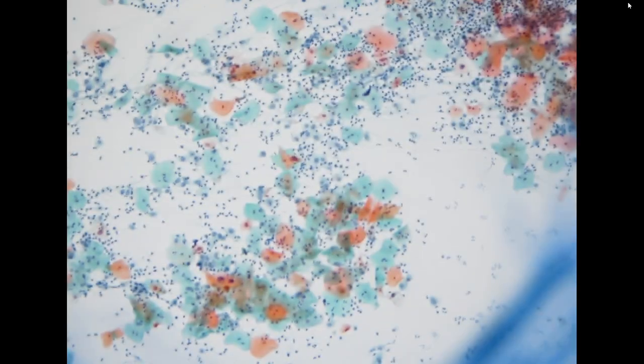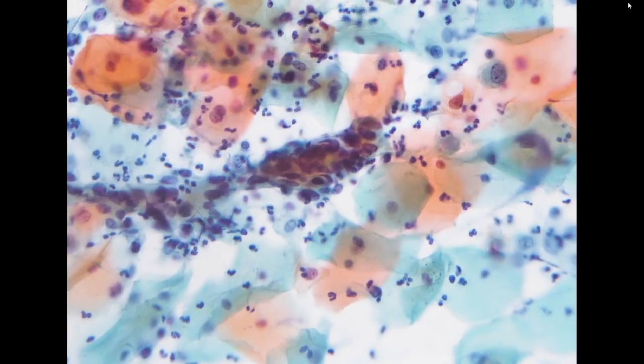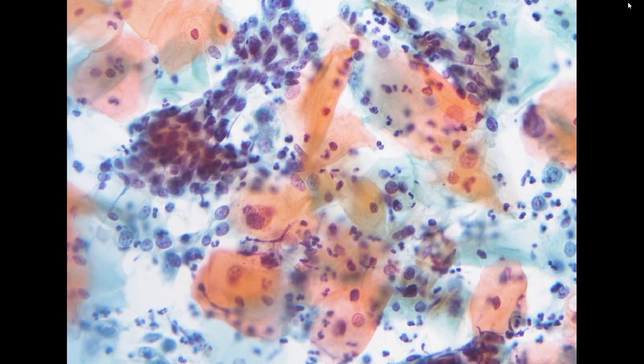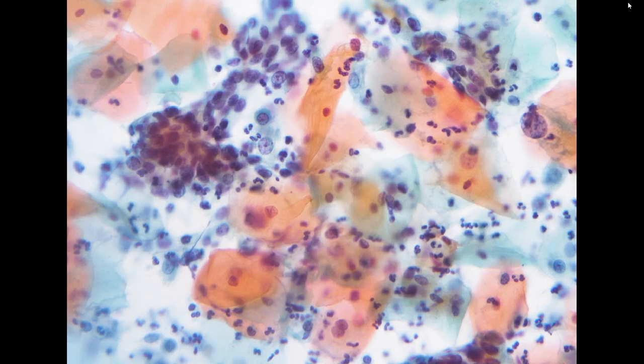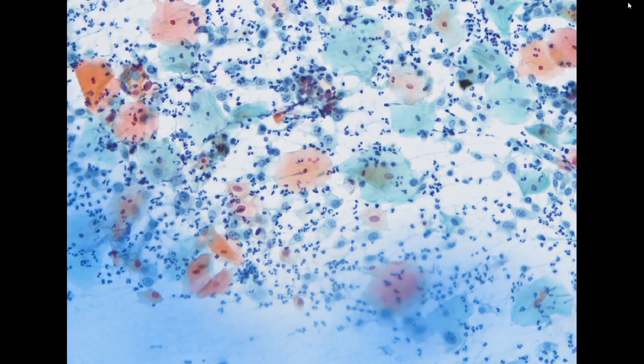For microinvasive SCC, usually you won't see very prominent tumor diathesis for the diagnosis. So I think there is a chance for microinvasive SCC in this case, but because of this pap smear, and we didn't see any very good tumor diathesis that would make us confident enough to call it SCC, we will call this specimen HSIL.